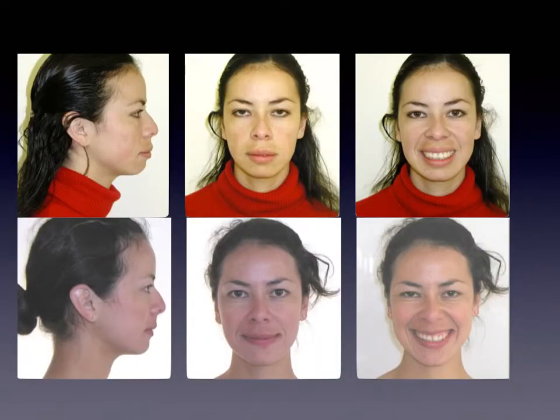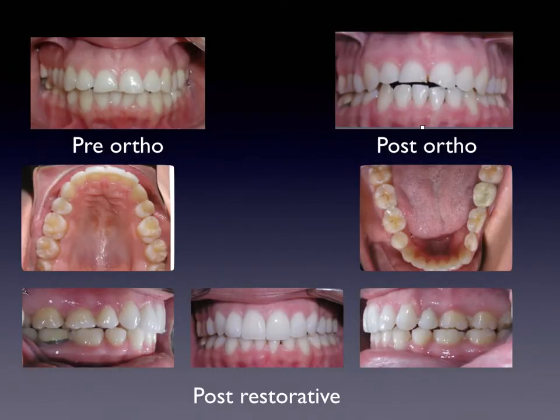And here's her before and after pictures, and then here's the before the restorative and then the after restorative. So that came out really nice. She was very happy with that.